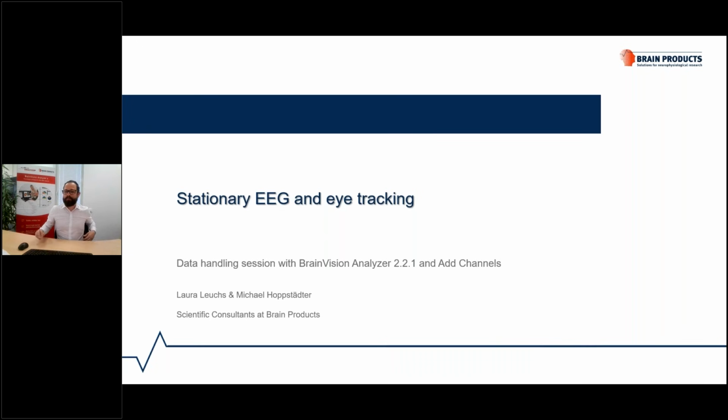Okay, so perfect. Thanks for this first part, Laura, for this hardware part. And also thanks to Christina for the kind introduction from the beginning. So I would take it from here, and now we would switch over to BrainVision Analyzer and look into the data and do something out of the combination of EEG and eye tracking.